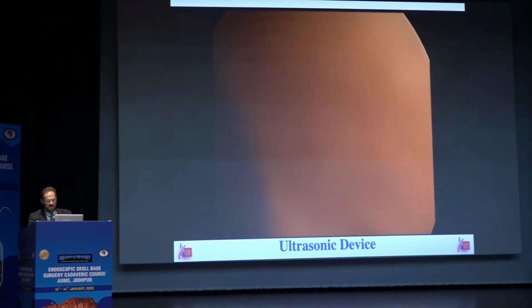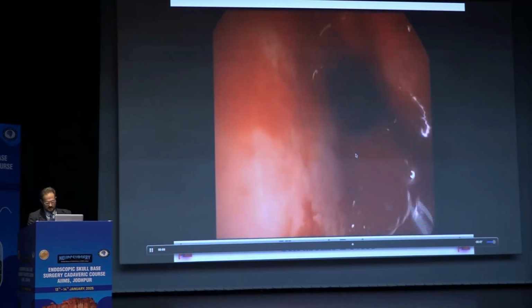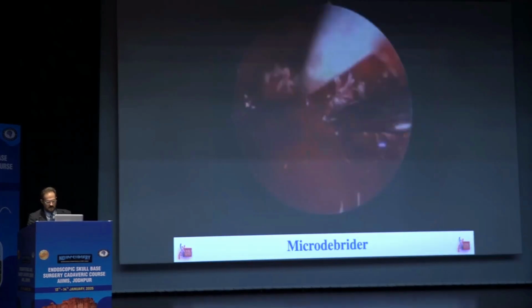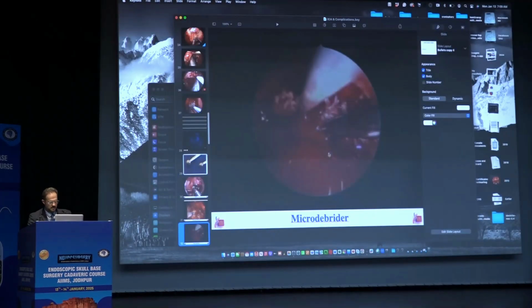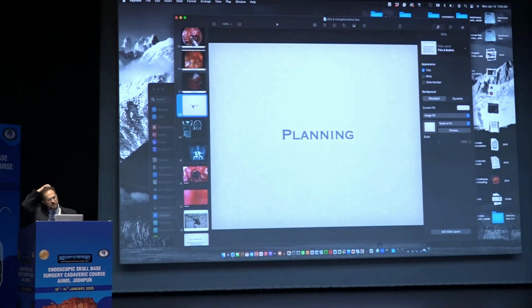So the bottom line, in terms of what to do for reconstruction, you always have 3 options. This is using an ultrasonic device. The company may tell you that nothing happens, but you can also have a carotid rupture with those. So, just to stop here for a second, for the 3 options you have once you have a carotid injury, first of all, I do think it should be done in an environment where you have the angiogram and endovascular team ready to go if you're doing high complexity surgery.